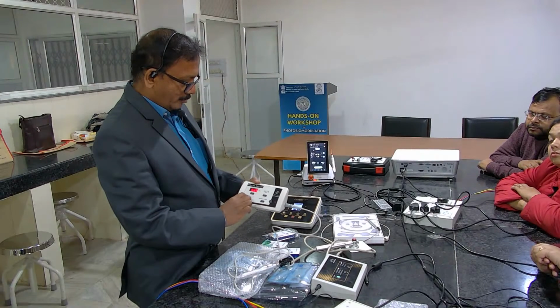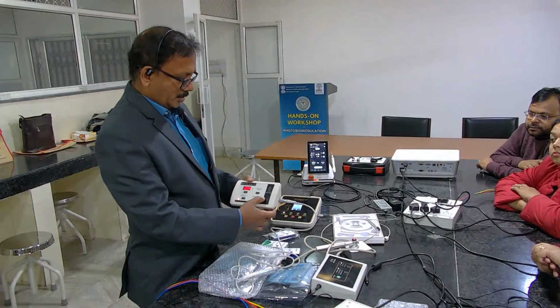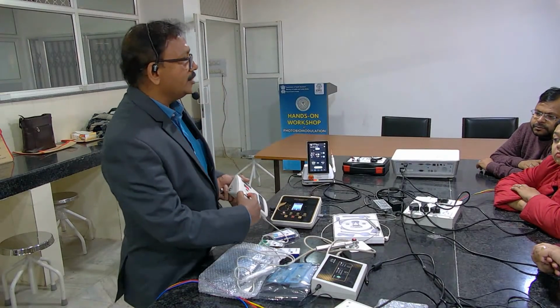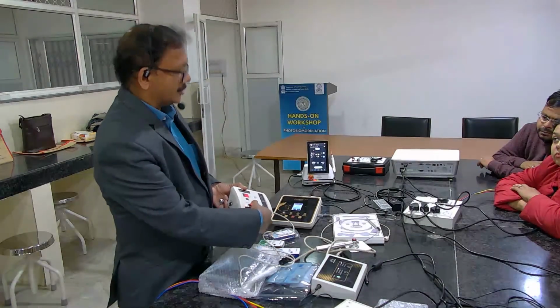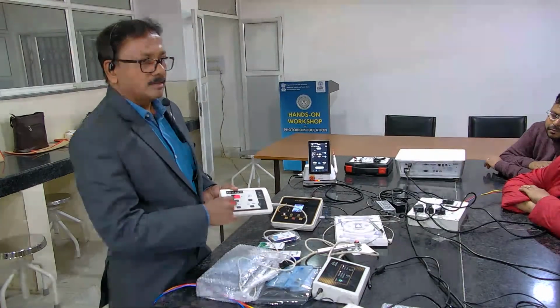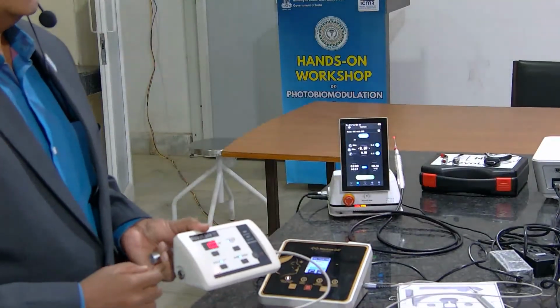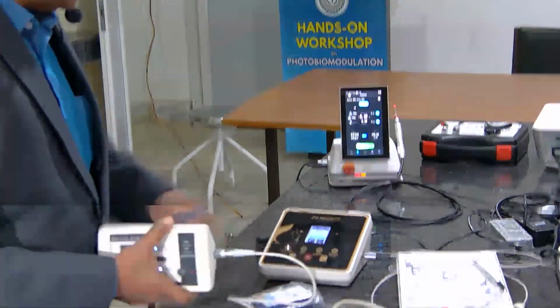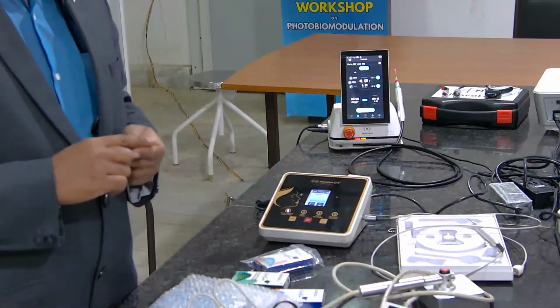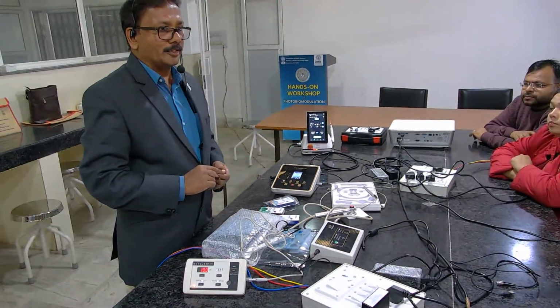So we have made it a very simple one. One, two. This is three, four. Start. If this light is blinking here, it is continuous, and if this is pulsed. So if I press again, it has gone into a pulse mode, and a straight line means continuous mode. So with photobiomodulation by default in these machines, you need not crack your head saying, now I am doing PBM, should I keep it in continuous mode or pulse mode? By default it will take you to continuous mode in photobiomodulation.